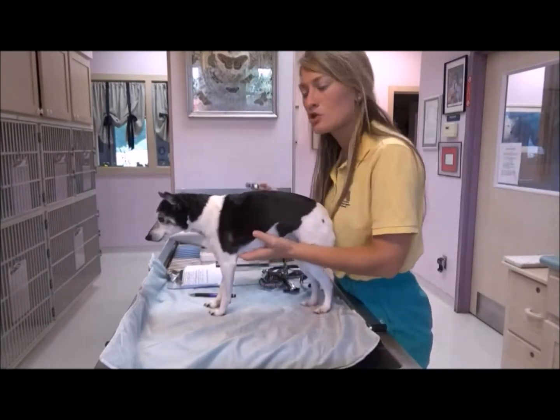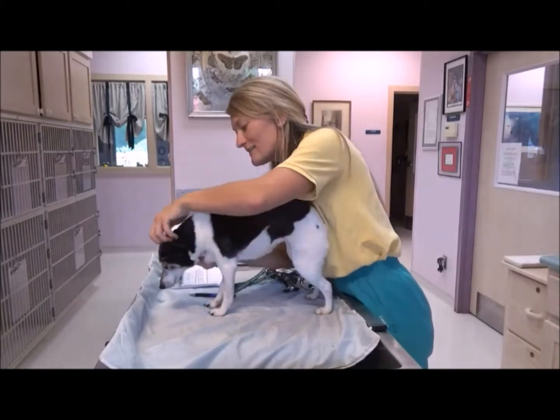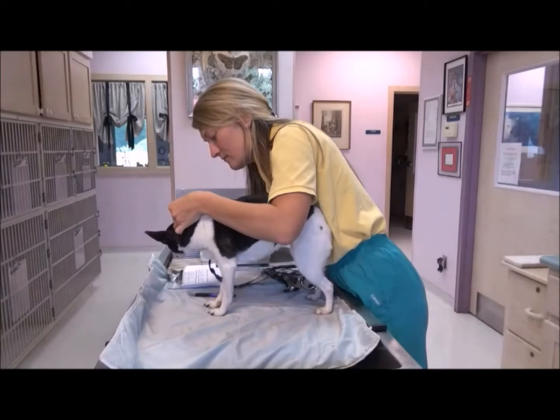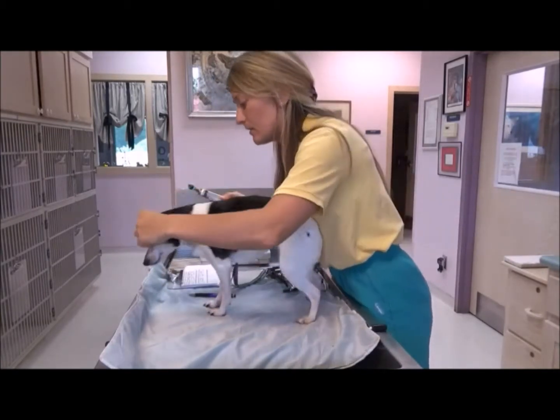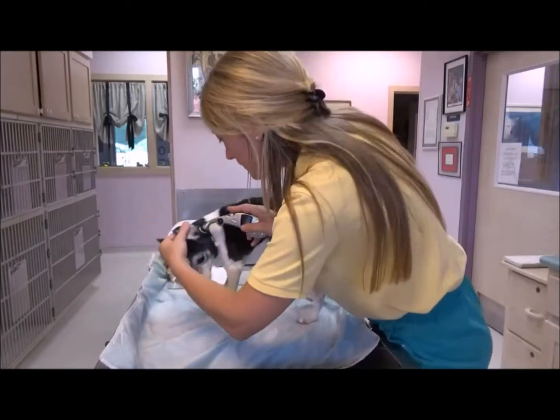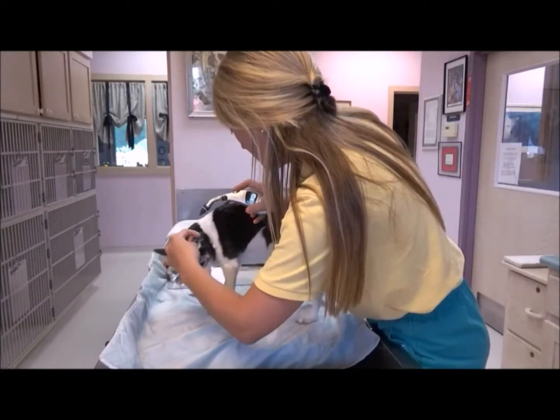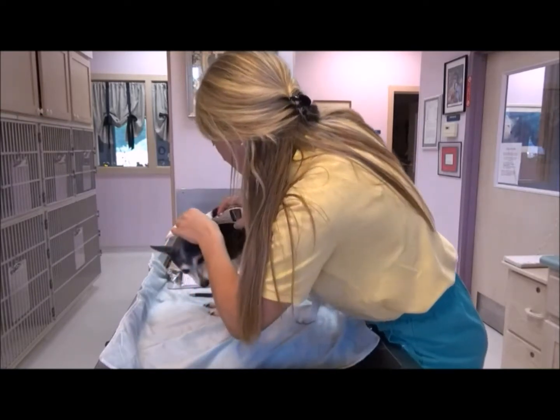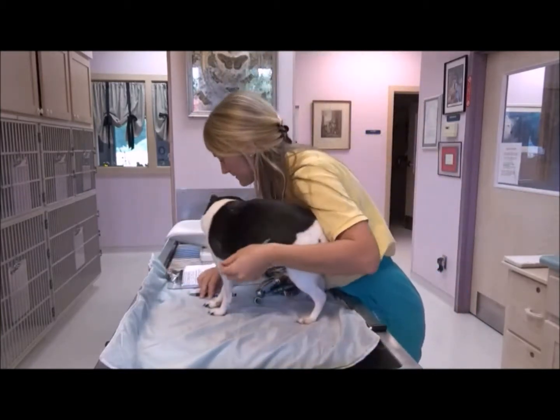We're going to check her temperature, and I have an ear thermometer we're going to use for her today. She's got these nice big ears, which makes it easy. Good girl, good girl. Oh, that was low. Hang on. Let's try the other side here. Alright, 100.5, so that's a good number.